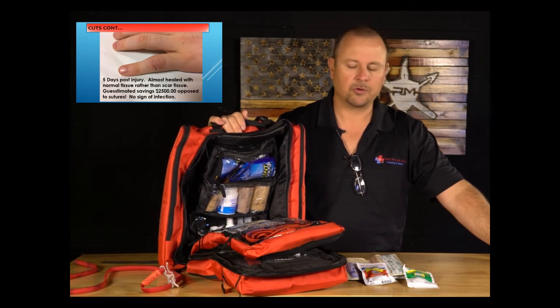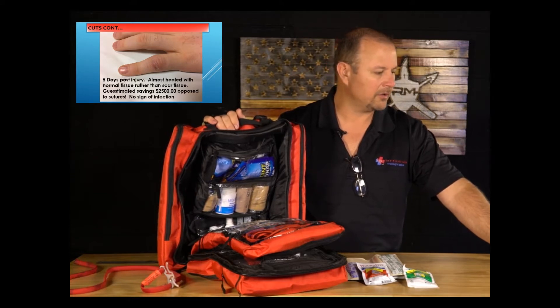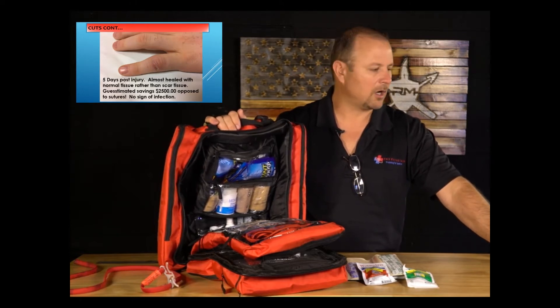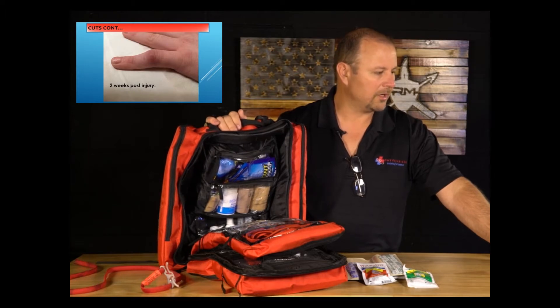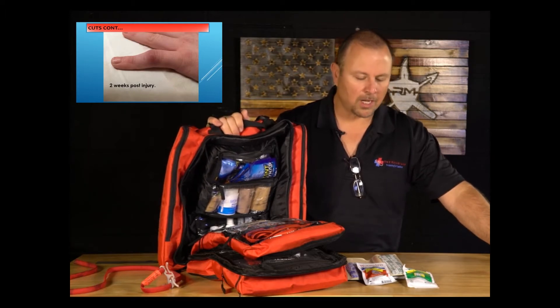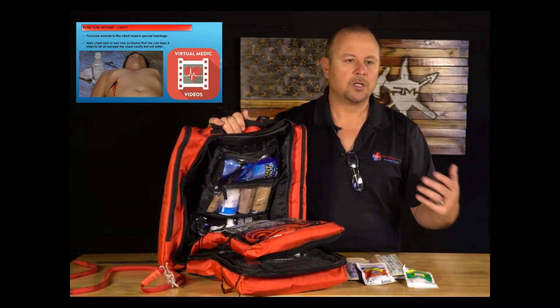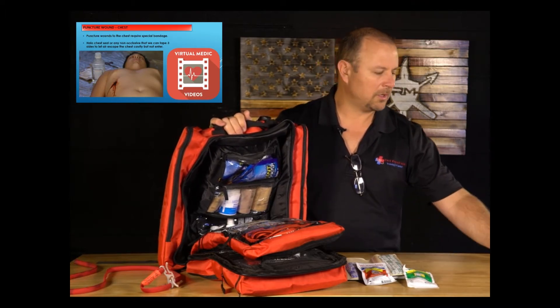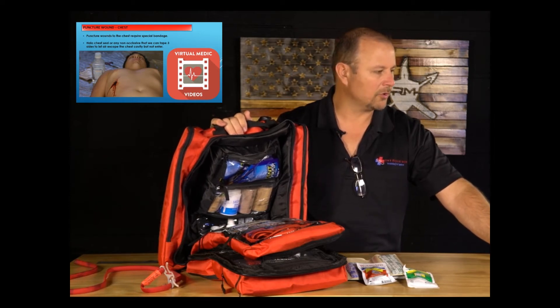Two weeks post-injury, the finger was completely healed with very little scar tissue. These kits are not a basic first aid kit — they're built and designed to take care of you in a disaster and save costly ER visits. In the app we also cover punctures to the chest, so go to the section that talks about chest seals for videos on those products.